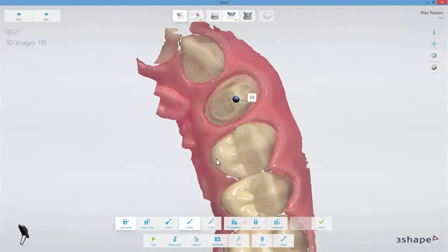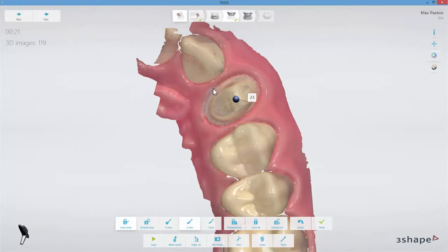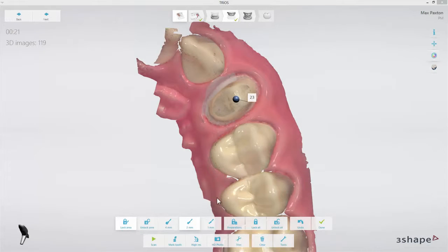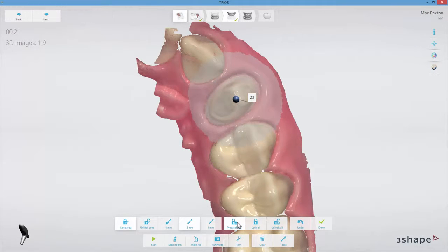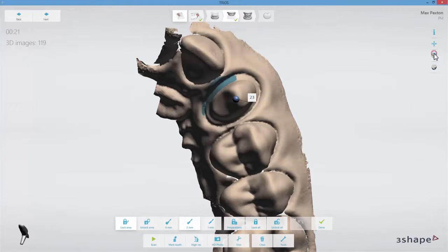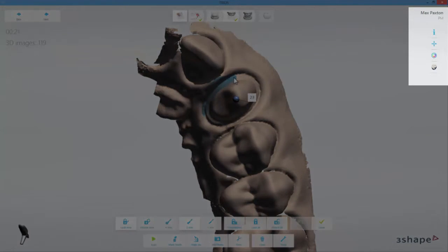This feature gives you a toolbar where you can select a brush size and simply lock an area by painting it directly on the model. You can also select Preparations, which locks a diameter around the marked tooth. It might be easier to see the locked area if you switch off the colour in the menu to the right.